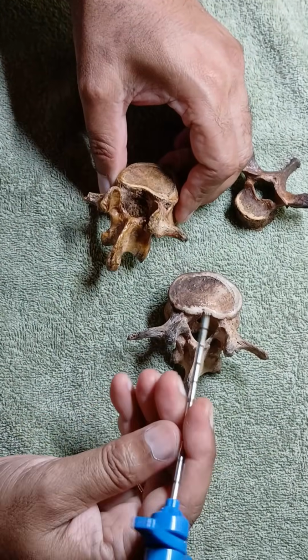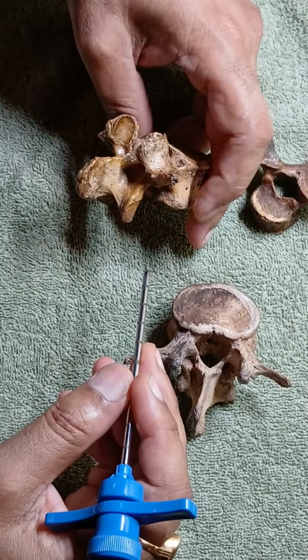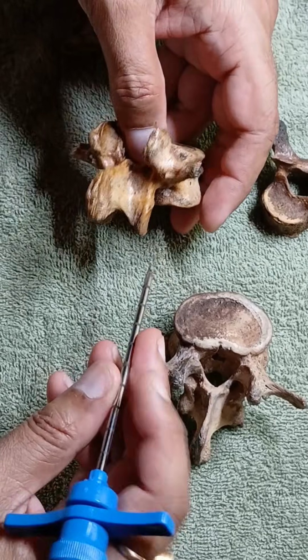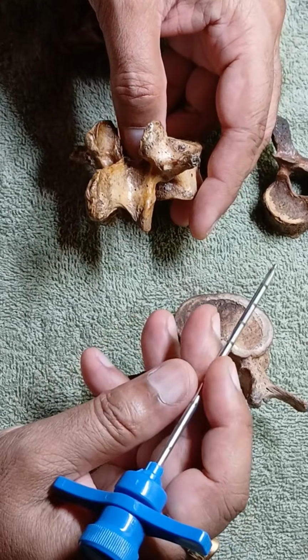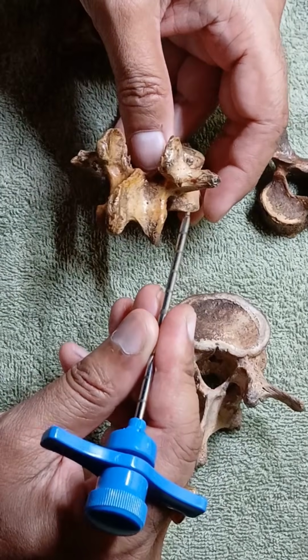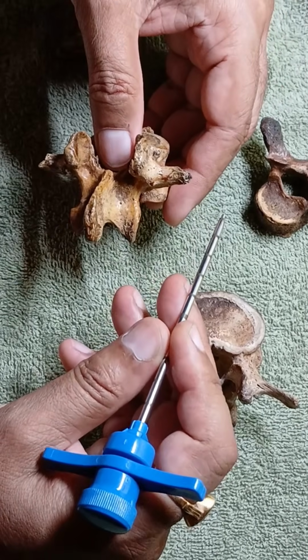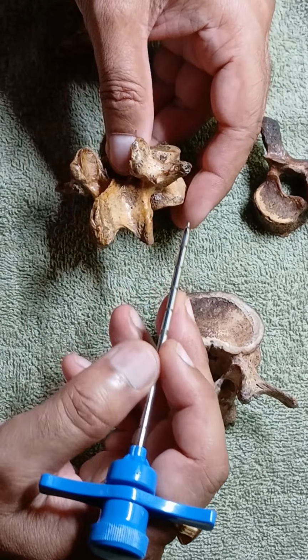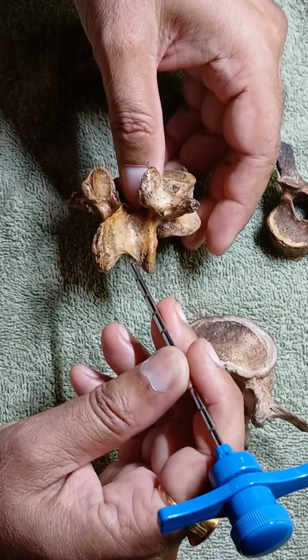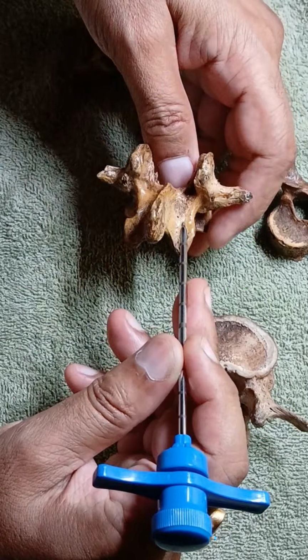Today I am going to describe to you the real anatomy of the vertebroplasty procedure. When we see in the fluoroscopy what our target is and where in reality we are putting the needles, if you understand this, then you will come to know what we have to learn, what we have to feel, what we have to see, and what we have to imagine.